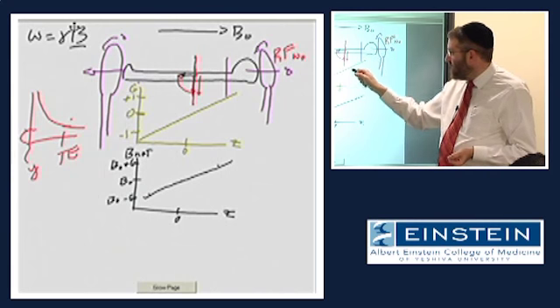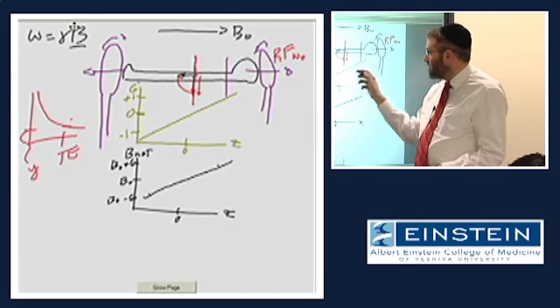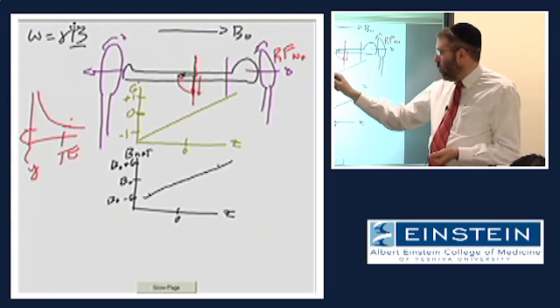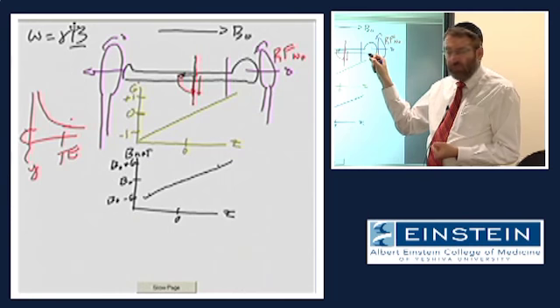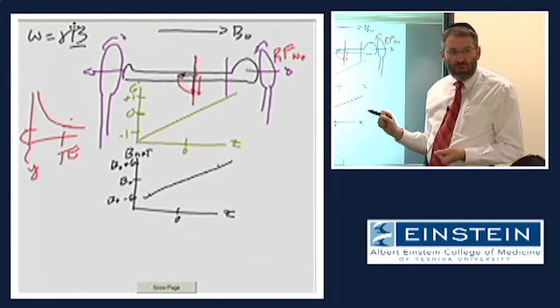So if we turn on our gradient magnetic field with a fixed strength, you know what that strength is based on how much current you dump into those gradient coils. We can predict what the precessional frequency will be at each location along the dimension of the gradient magnetic field because we know what the gradient magnetic field strength is.